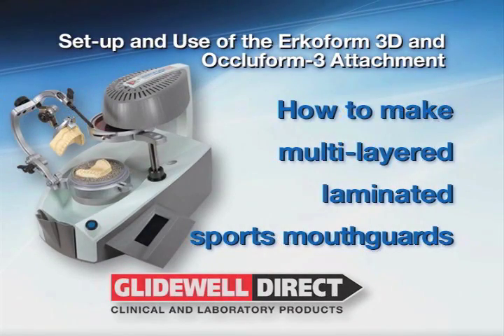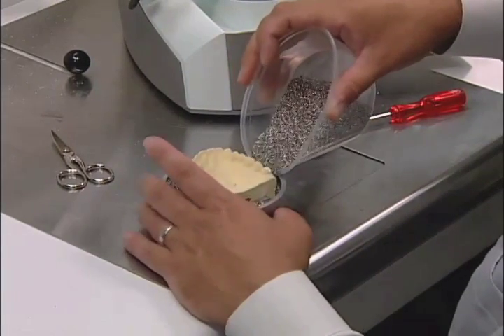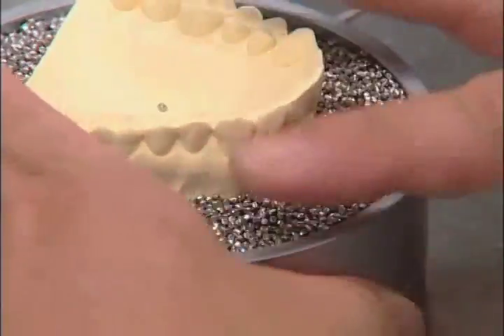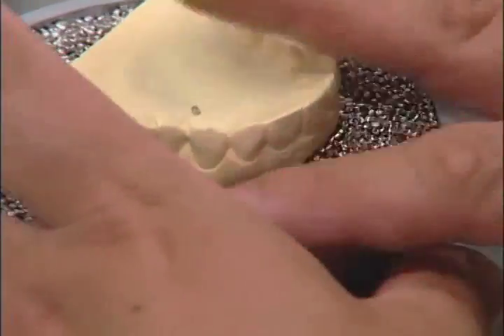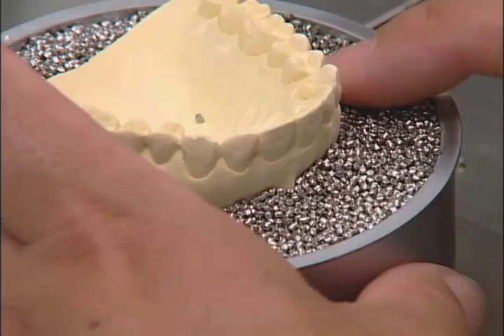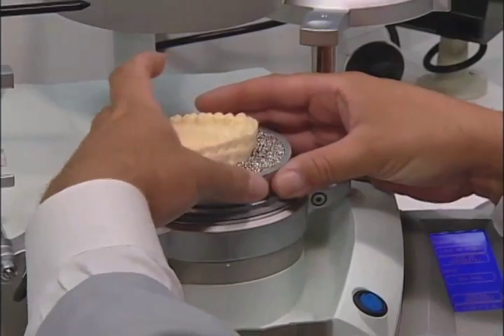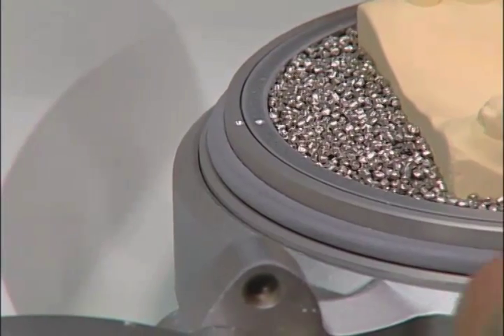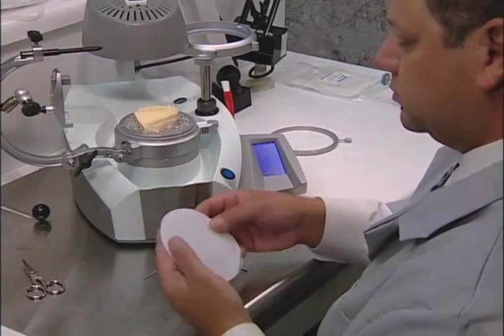How to make multi-layered laminated mouth guards. First, embed the model into the granules. Cleaning the granules away, be sure to expose the vestibule area. Place the model pot with the model into the unit. Once the points are lined up, the model will engage into the centering plate of the unit. Place the UCF spacer on the model side of the thermoforming disk.